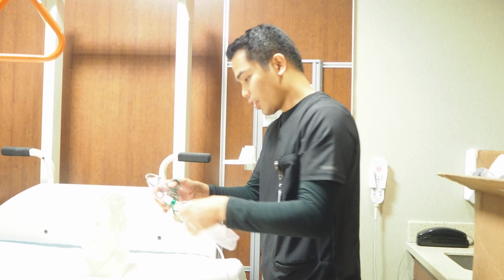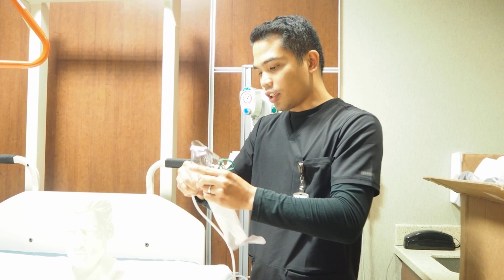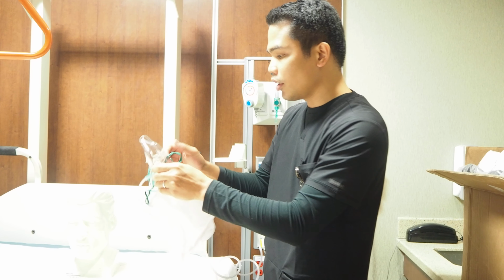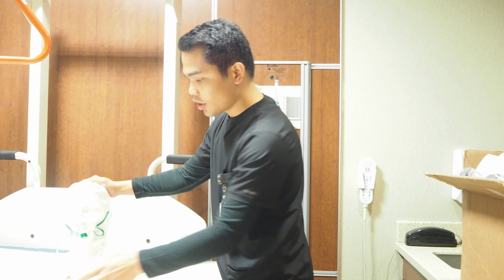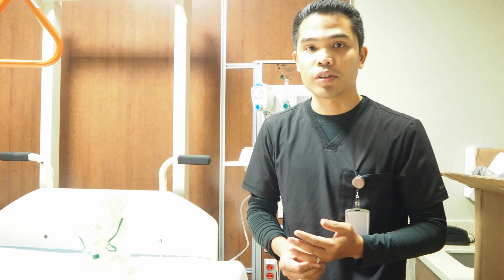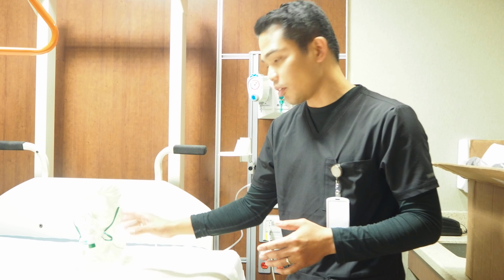So once you feel, or assuming this bag is already inflated, make sure that the connectors are no longer kinked, and then you observe that the bag is inflated, and then of course we always put this on the patient. In that way, because the patient has COPD, he or she will not retain any carbon dioxide. So after that, make sure that the bag is not deflated, especially if the patient breathes in.